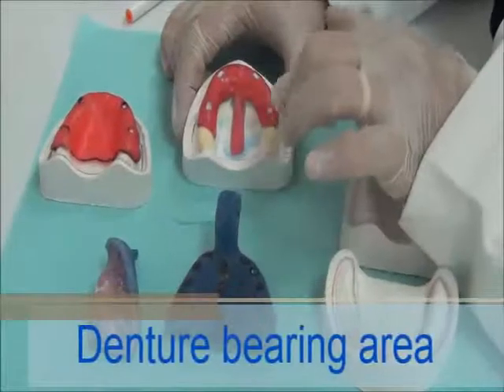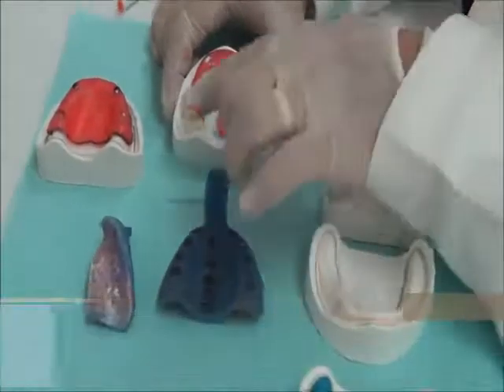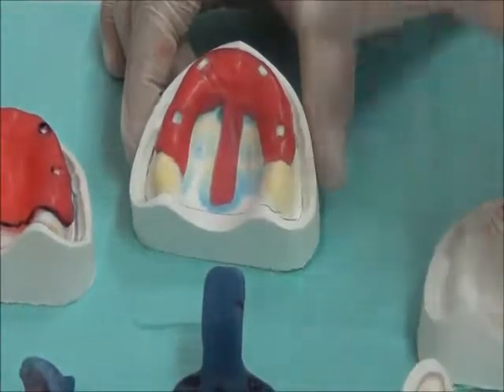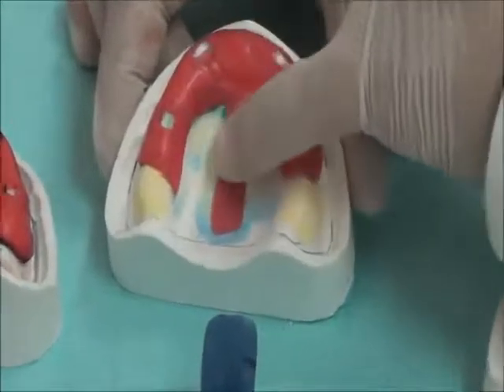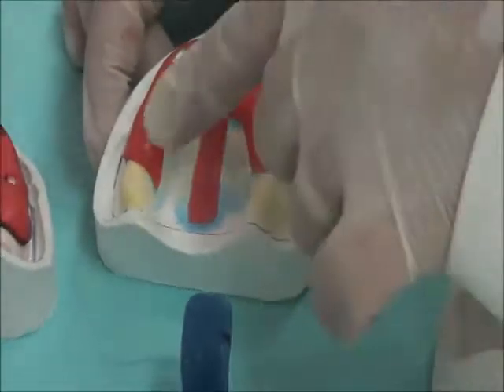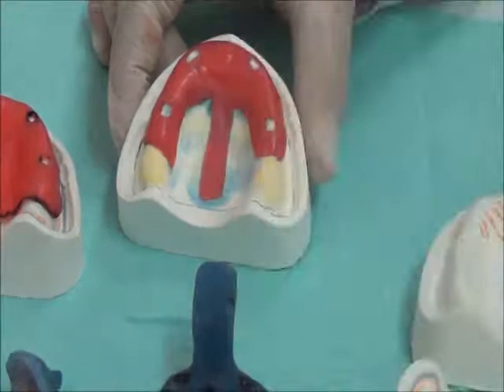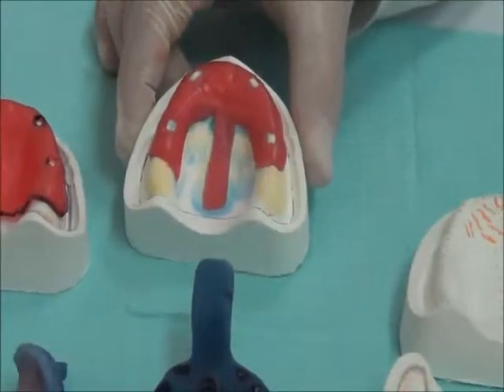On this cast, you see that the denture-bearing area is divided into two parts. The areas that will be compressed, and those are called primary support areas, and the areas that will be relieved, and these are called relief areas. Why do we need not to compress these areas and leave the impression material in a mucostatic stage and not press it as we can do here and here? We need to look closely at the histological section of these areas.